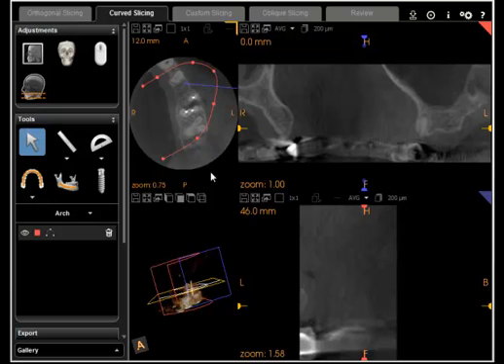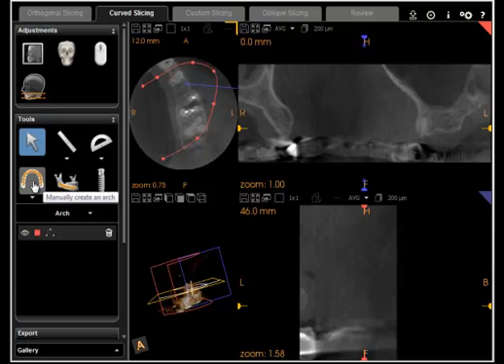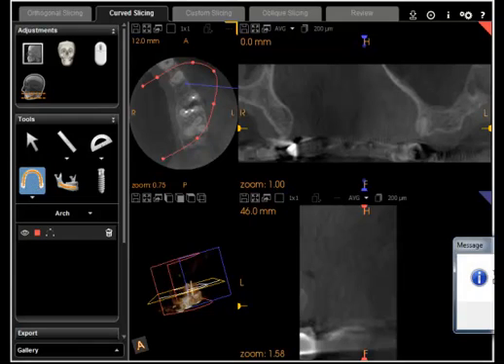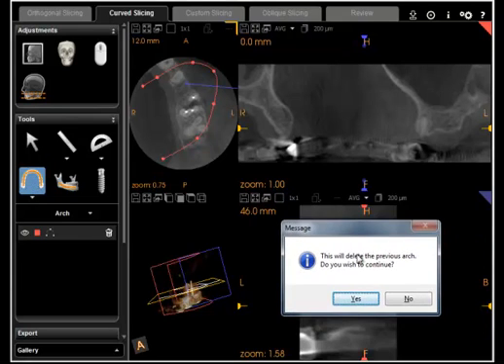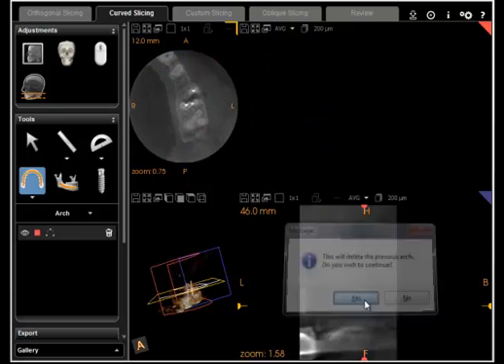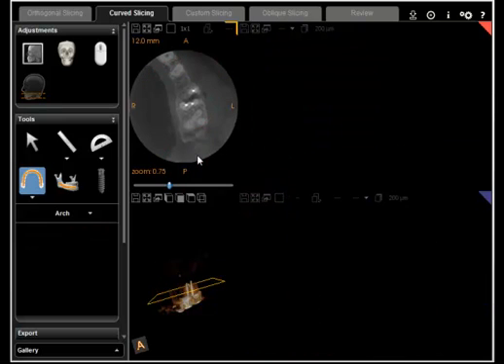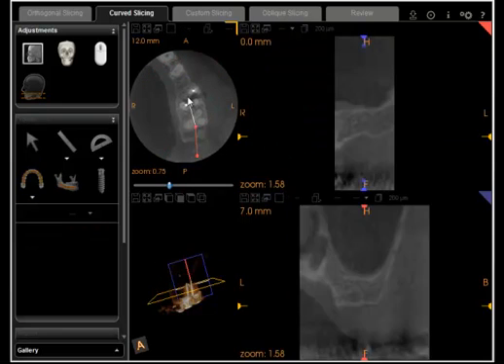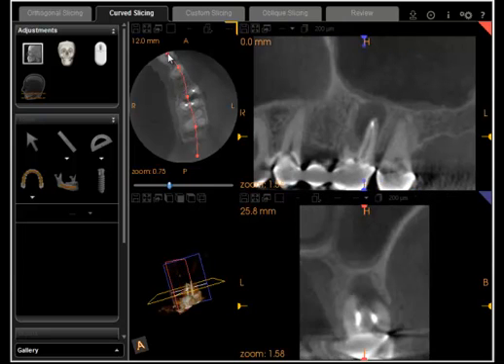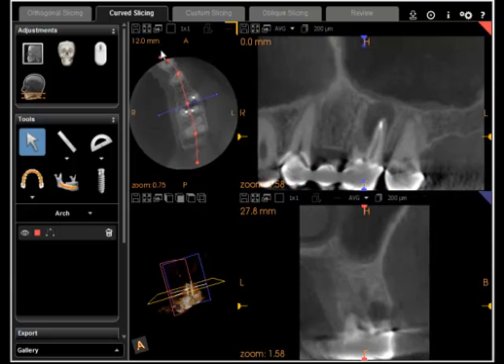The curve slicing allows you to create a slice that goes along the curve of the arch. Sometimes the initial software does a pretty good job, but in this case it's not even close, so we click on this icon that says 'manually create an arch.' You left click there and it says do you want to delete the previous arch and we say yes. Now in the axial slice we simply left click several places along the arch, and when you're finished you double left click.